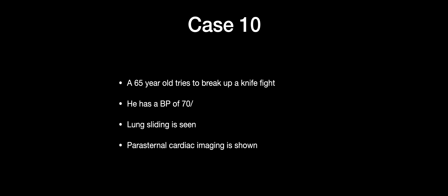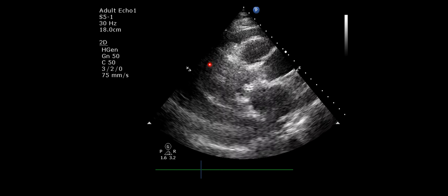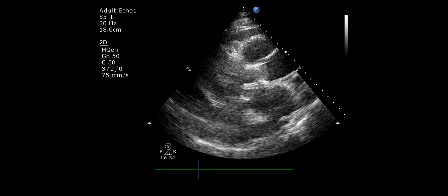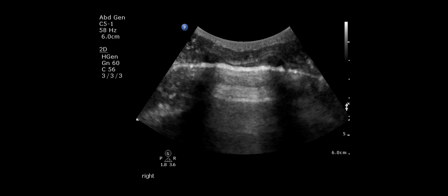Case ten is a 65-year-old who tries to break up a knife fight with a blood pressure of 70 systolic. Lung sliding is seen on both sides. Looking at the pericardium: there is a large pericardial effusion with the left ventricle, right ventricle, and aortic root visible — the heart is swaying within this effusion. This person has evidence of tamponade. In the context of a penetrating chest injury, the chest needs to be opened, which is a challenging decision depending on available equipment and resources.